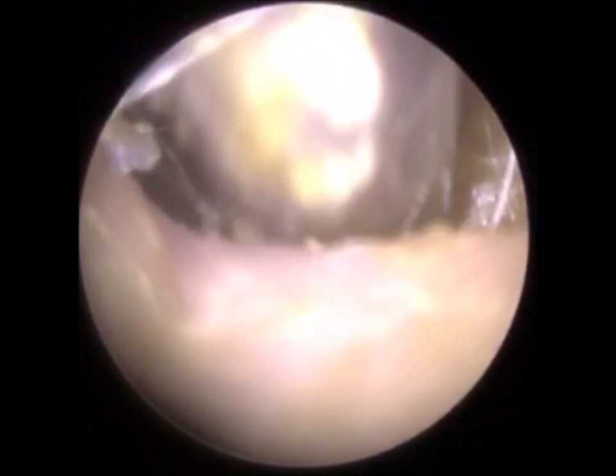So again, just using some Henkel forceps, I managed to remove a piece there, and you can see it did shred off. I've just got another piece, but unfortunately it's shredding a bit. It just shredded there. I was hoping that big plug came out in one go. Nonetheless, although I'm shredding it, that is still removing it, so I just have to keep going back and take little segments out. It's not ideal, it's a bit time consuming, but patience is a virtue.